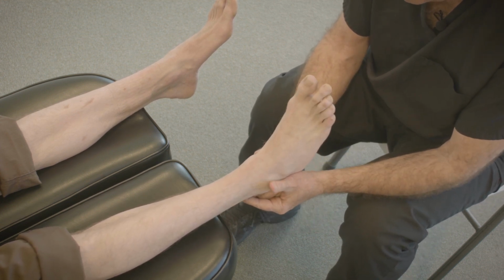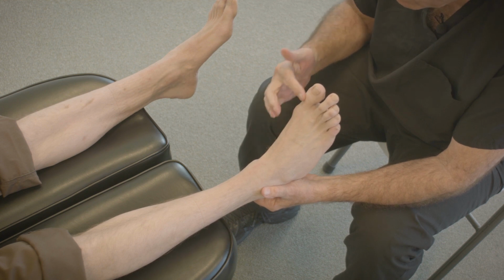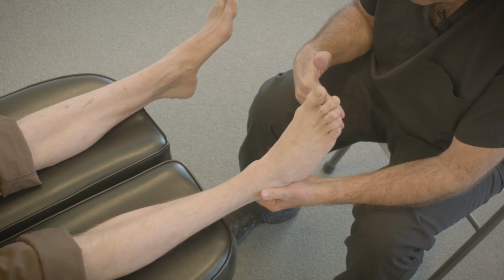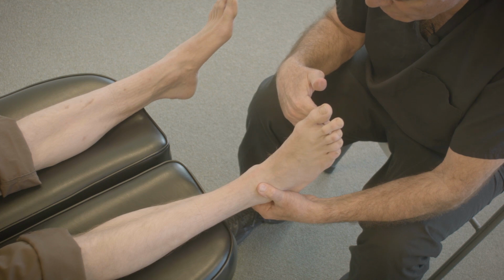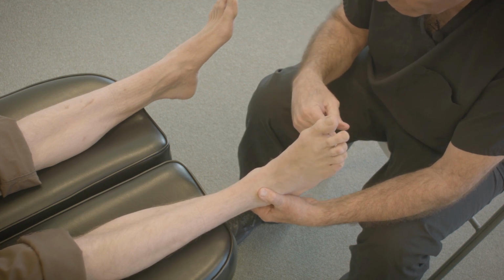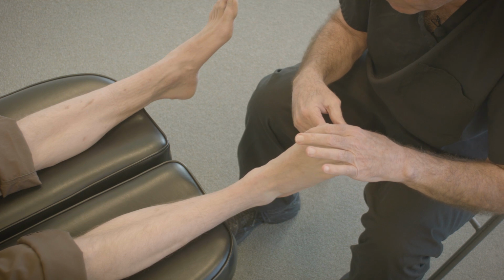Now, also, in this exam and demonstration process, we like to show the patient the effect of pronation on functional hallux limitus. Mr. Jones, when you pronated your foot, it drives this bone by your big toe joint upward. And I want to show you what happens when that bone is pushed upward. This is your first metatarsal. It jams the joint.